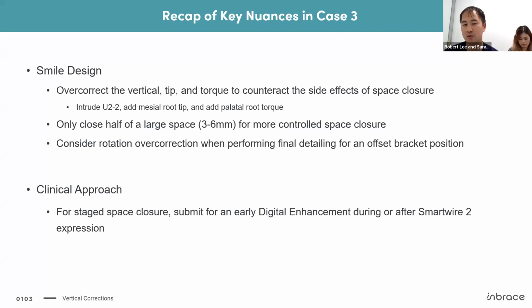For a large space, somewhere between 3 and 6 millimeters, you should only close half the space. If you're doing something like an extraction space that's even greater than 6 millimeters, usually we'll only close about a third. So it's staged into multiple components.